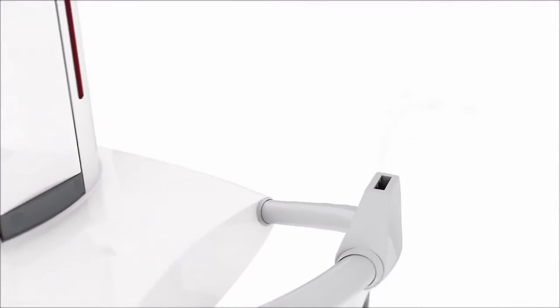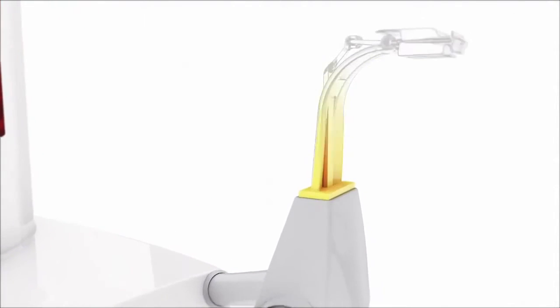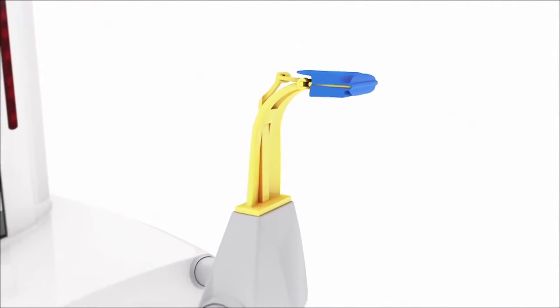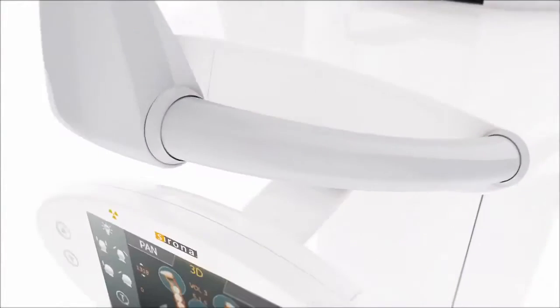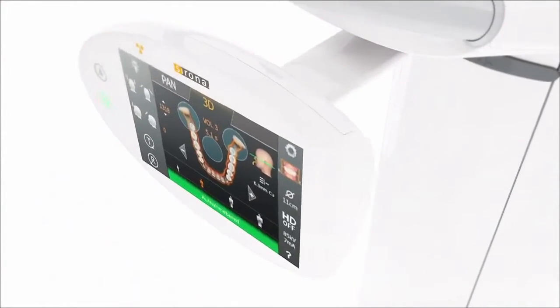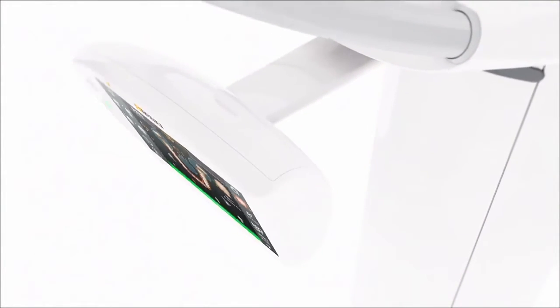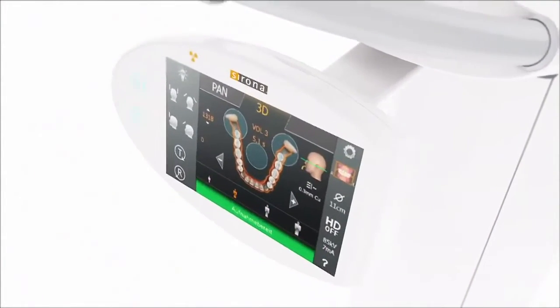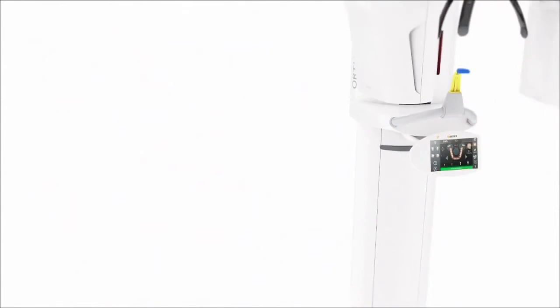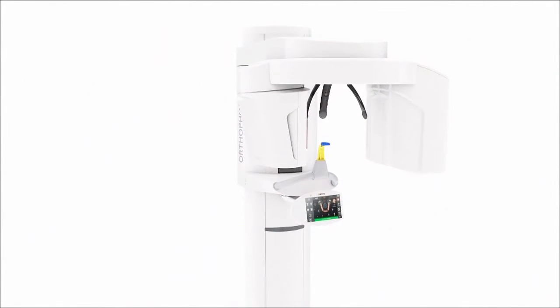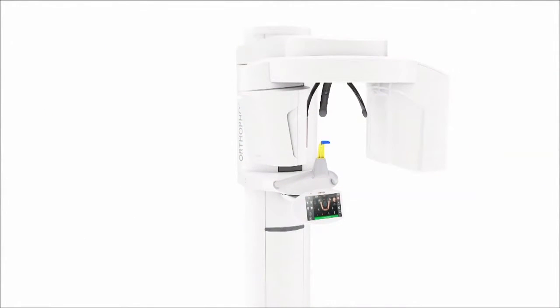Through the patented occlusal bite block, you can determine the optimal position of your patient at all times. With the swivel and tilt easy pad and the easy-to-grasp controls, positioning becomes child's play.